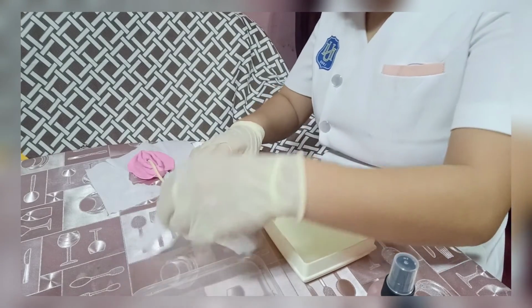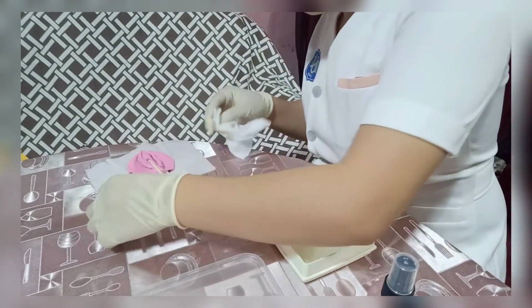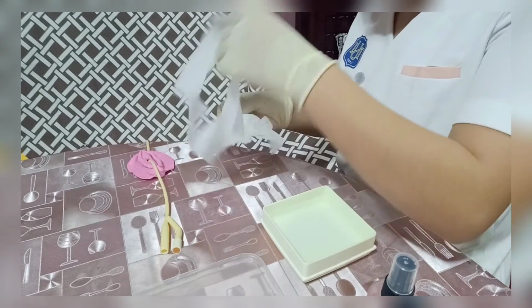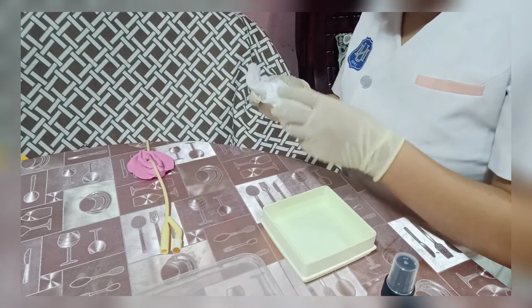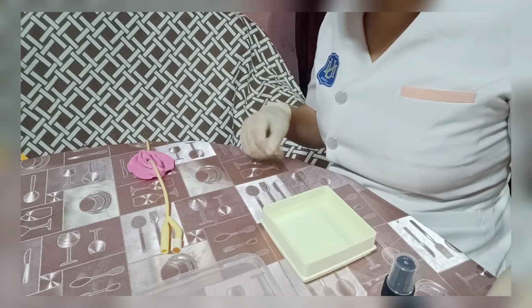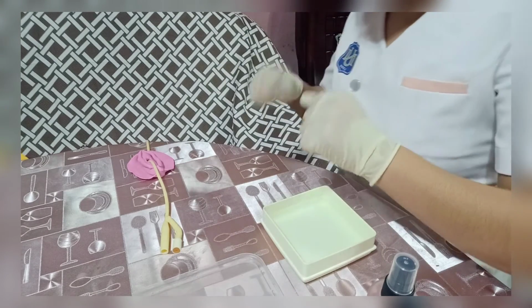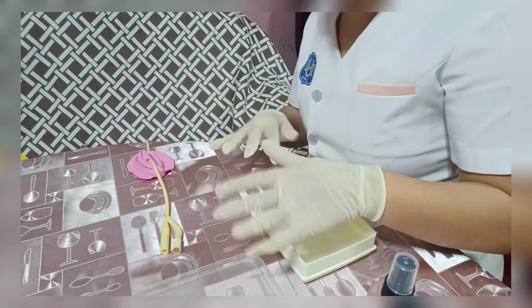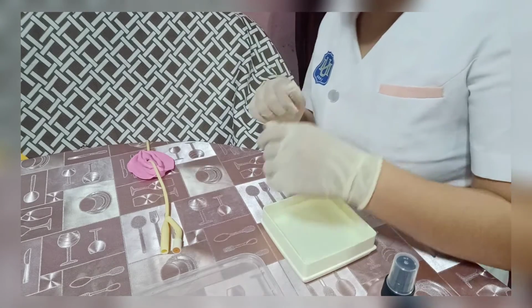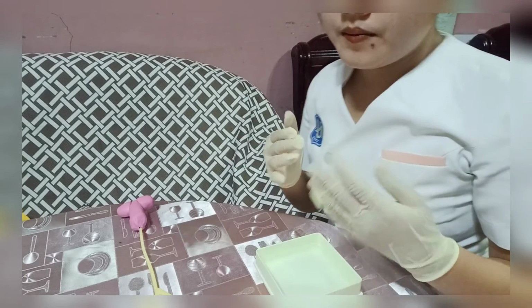After that, position our patient in a comfortable position and cover our patient with a linen or a towel.